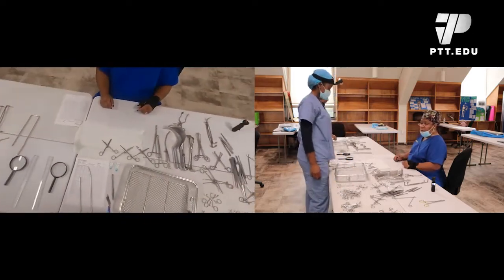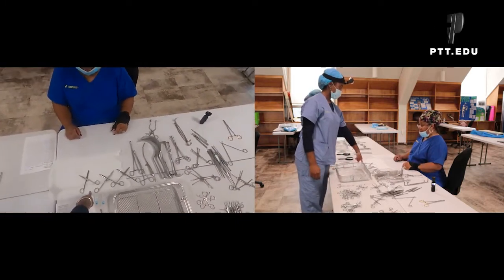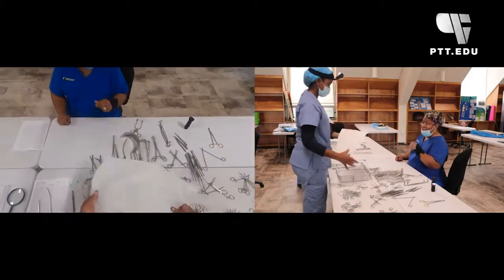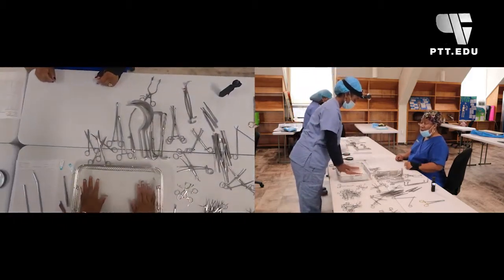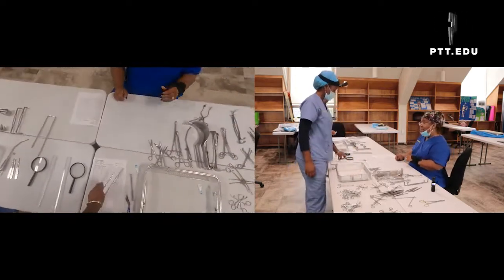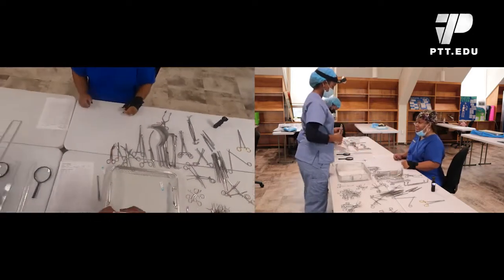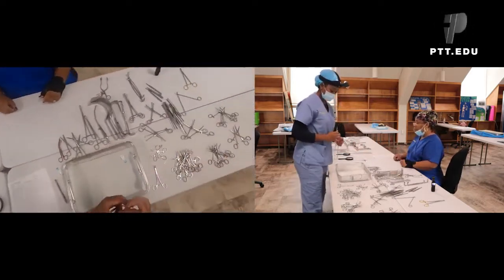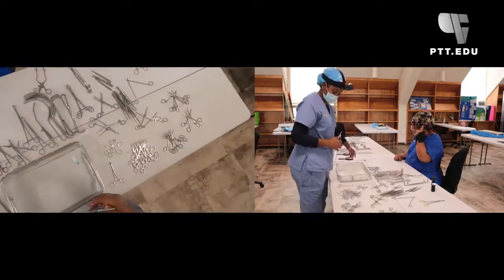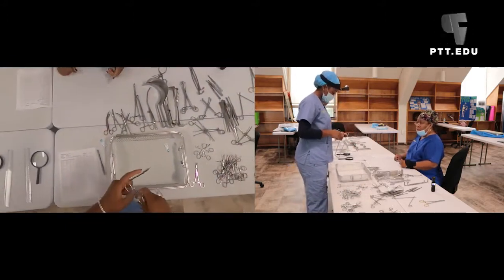So what's the first thing that you do when you strategically place all your instruments to the side? The tray liner. This is for simulation purposes only. There is a national shortage of tray liners in the country at the moment, so we're just using heavy duty paper towels for simulations. And then you begin to string the instruments, and you must go in order. The first thing that you should have on that should be your Crile hemostats, set straight. Is that true? Yes. Copy that. Then let's get them on there.